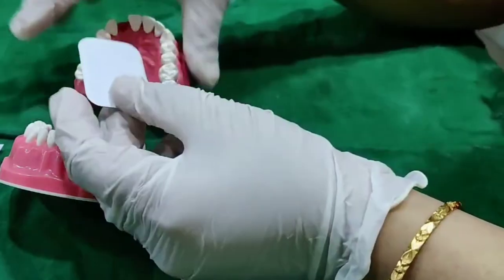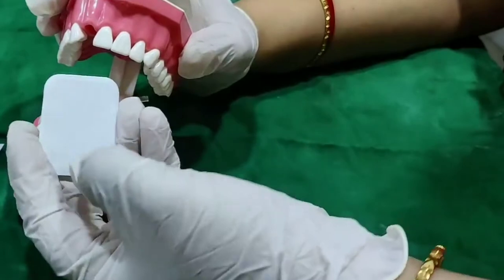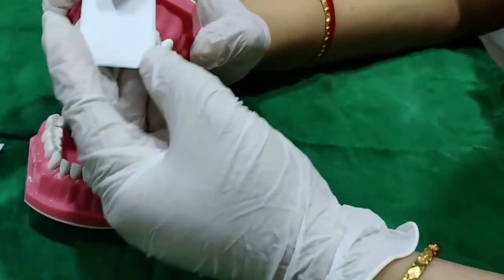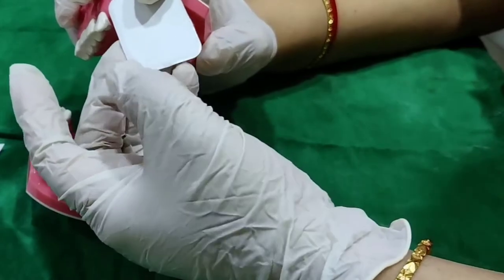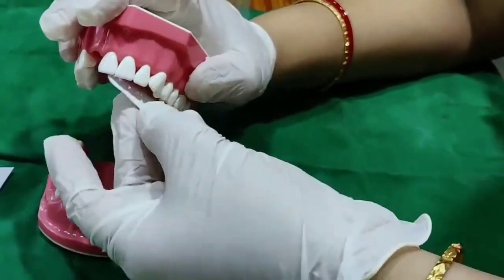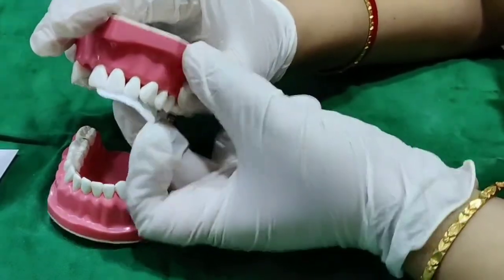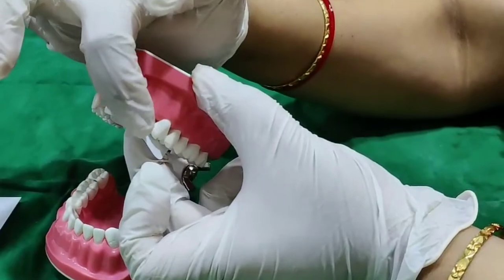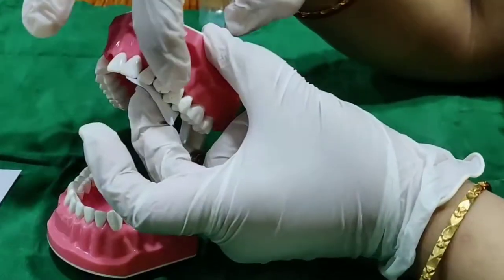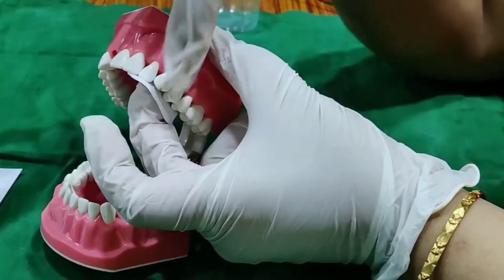Whichever tooth you want to X-ray, that tooth should be placed at the center of the film. For the canine, the roots are long, so you can place the film vertically with the raised dot facing down. The canine should be at the center of the film. This is the correct position for the canine.